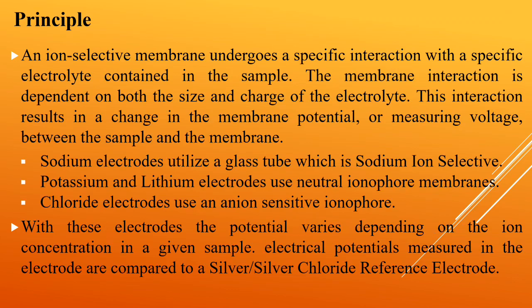This interaction results in a change in the membrane potential, or measuring voltage, called the electromotive force, which is produced at the membrane, between the sample and the membrane.